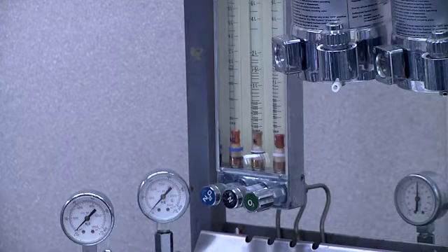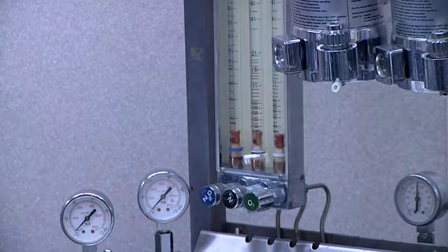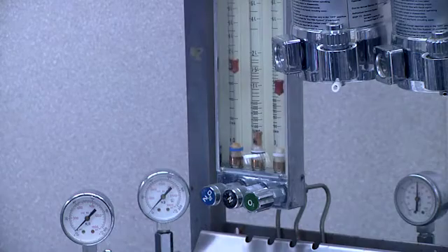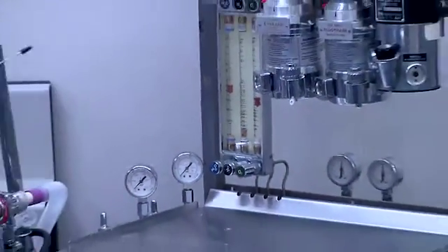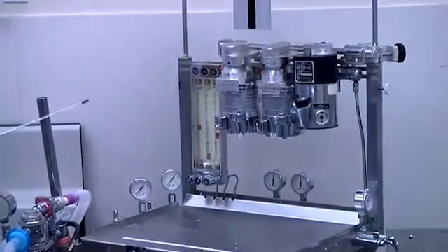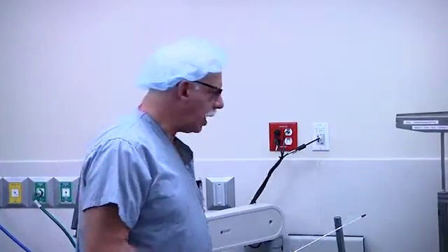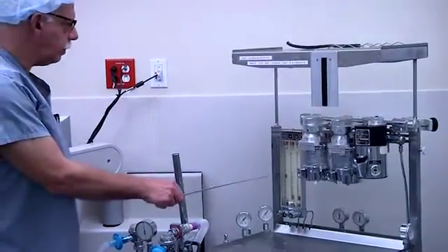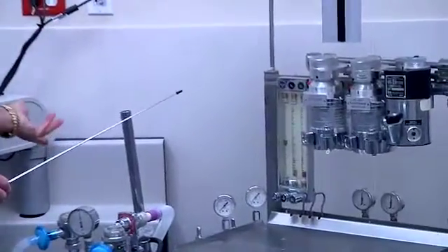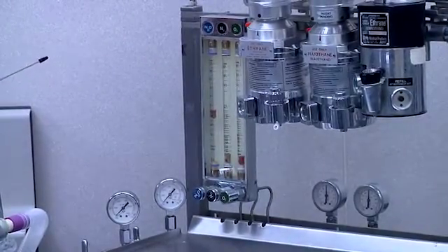Now we're going to restore the oxygen pressure either by reattaching to the wall pressure or opening the tank. This will allow the nitrous oxide or nitrogen once again to flow. The modern anesthesia machines have protection at the flow meter level known as proportioning systems — you can't give less than 25% oxygen. However, this machine did not have that feature. When we turn off the oxygen, we can still give 100% nitrous oxide or 100% nitrogen from the flow meter. So it has a functioning fail-safe but does not have a proportioning system.